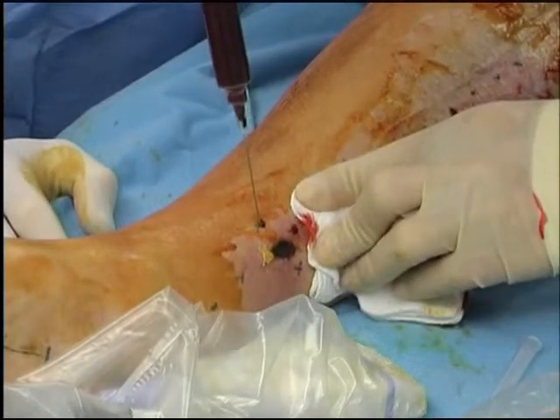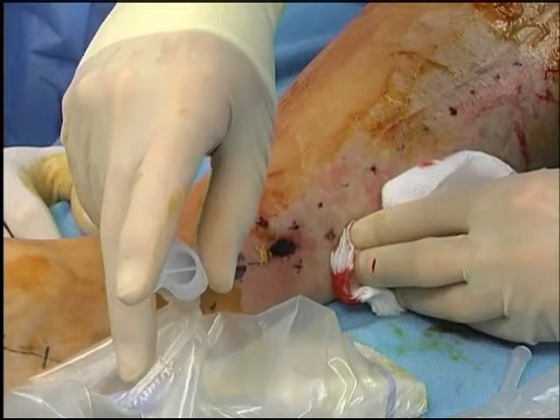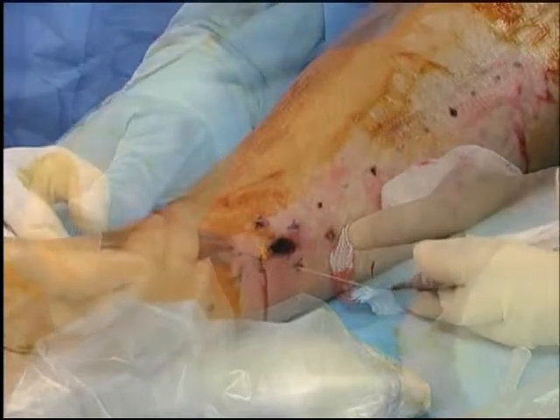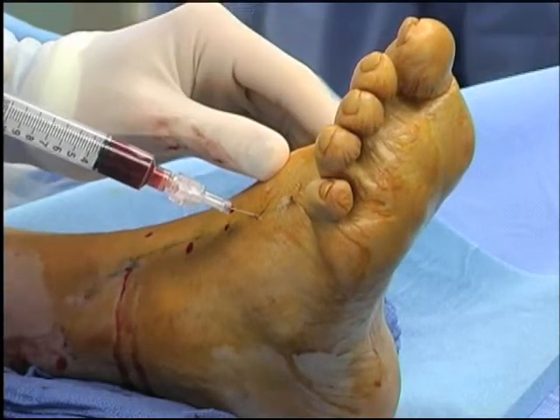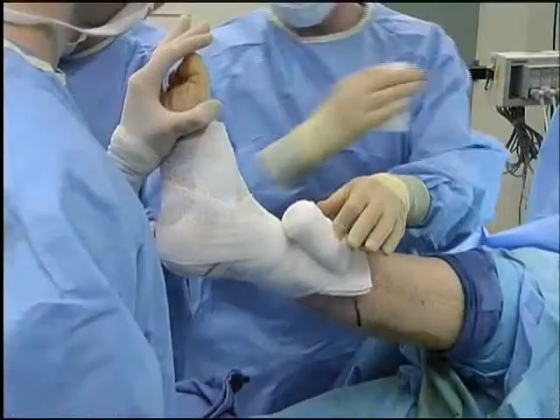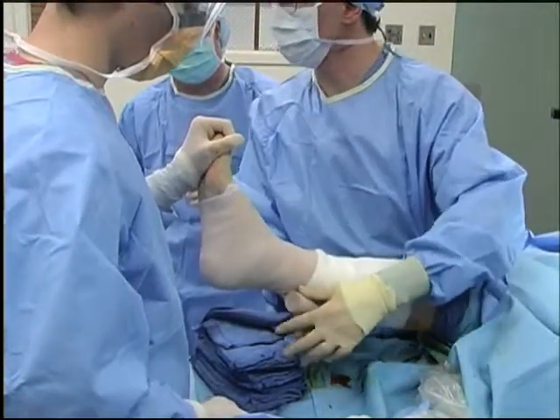The needle will enter the skin 0.5 to 1.0 centimeters from the edge of the wound and extend under the wound bed approximately 80% of the radius of the wound. The injection will be made as the needle is drawn back to the wound edge, delivering a 1 milliliter volume of injectate. Injection into the foot should be performed with a 26-gauge needle. The injection sites are to be covered with sterile gauze and the leg wrapped loosely with a sterile gauze roll. If wounds are present, they will be dressed according to the attending surgeon's protocol.